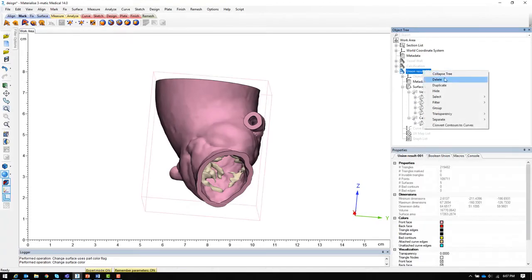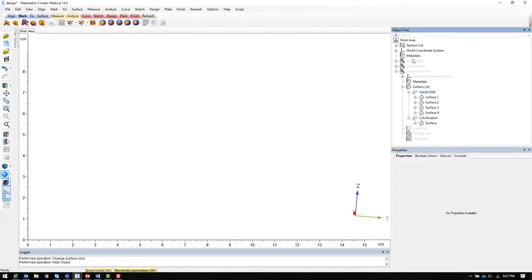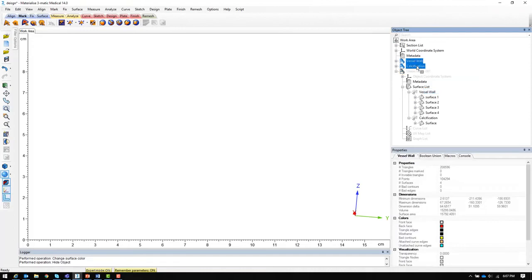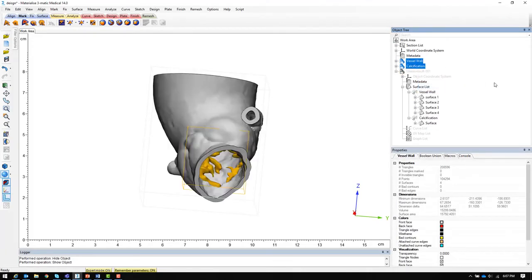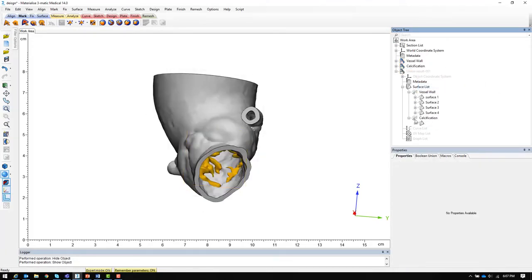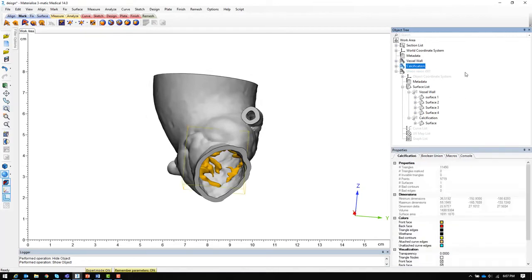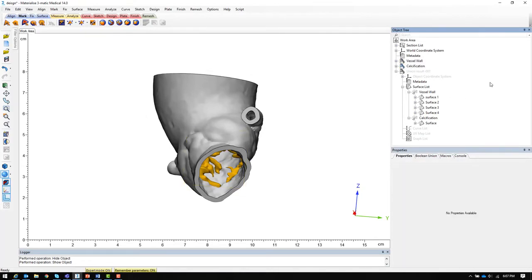Next let's take a look at the multi-material method. Going back to our original parts, we need to create separate files for each material being printed. In this case the vessel wall and the calcification should be printed in different materials.